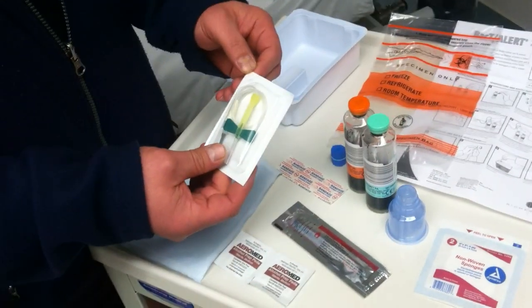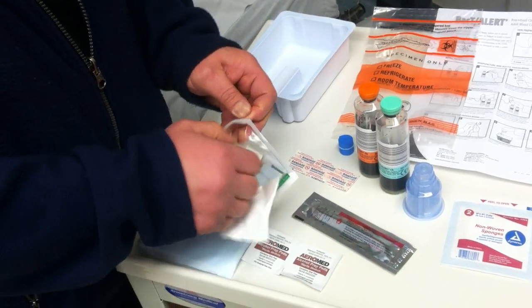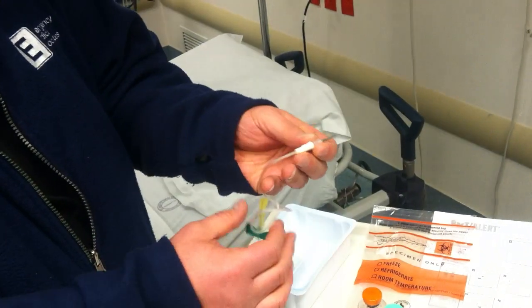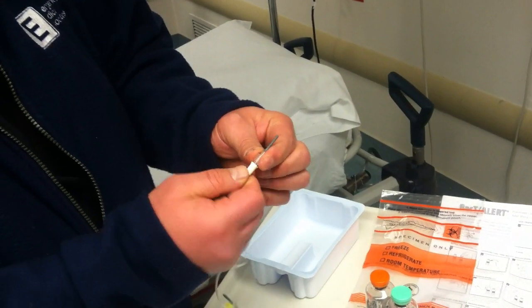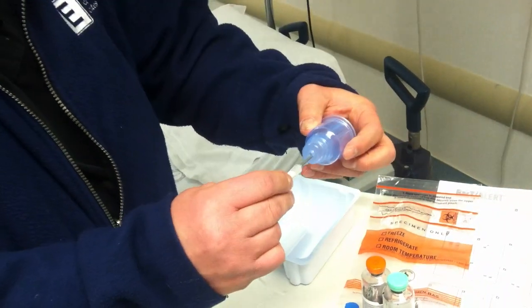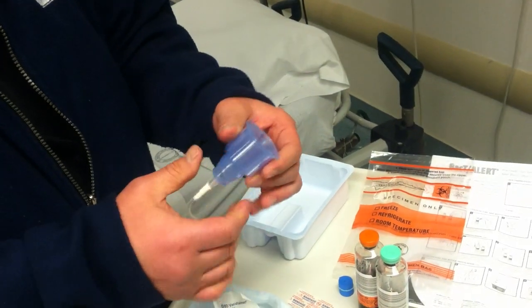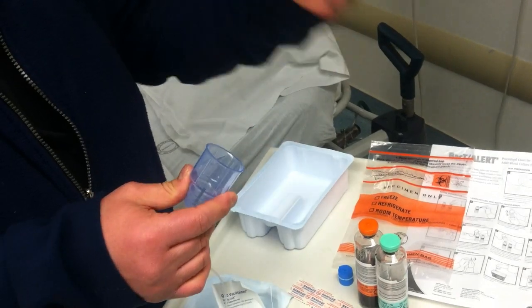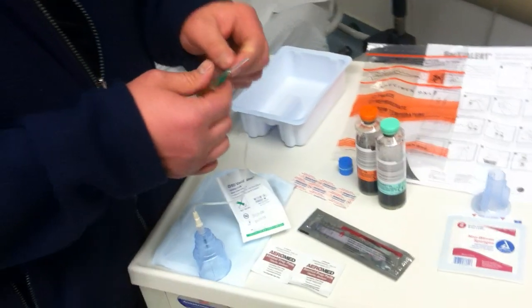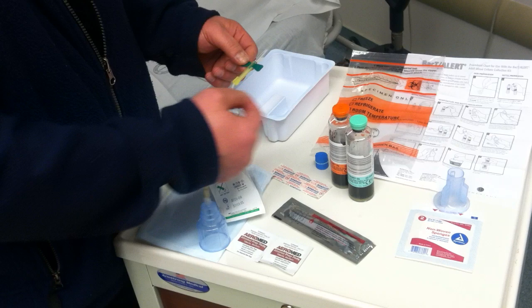Then we'll take our butterfly and open it. Make sure the butterfly is connected firmly onto the adapter, and then the adapter screws into the vacutainer holder. Since we're drawing blood cultures, we won't need the inner adapter. We'll find the vein, insert the butterfly into the vein, and wait for our flash.